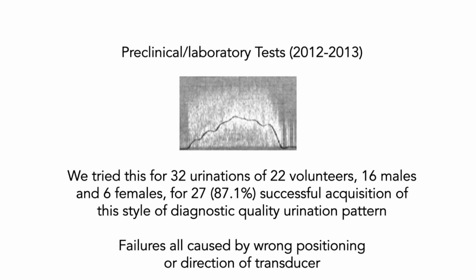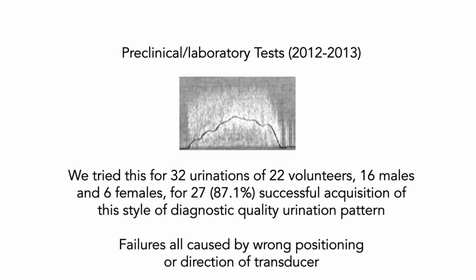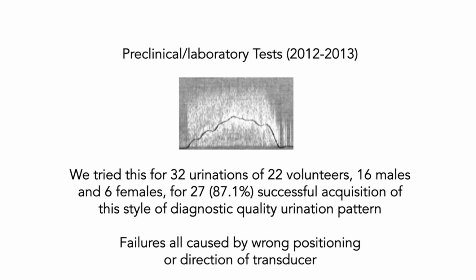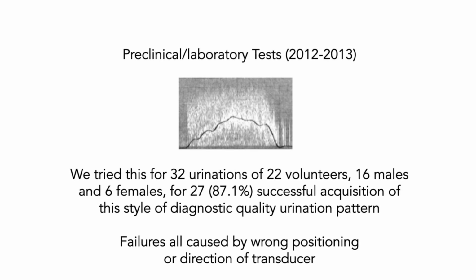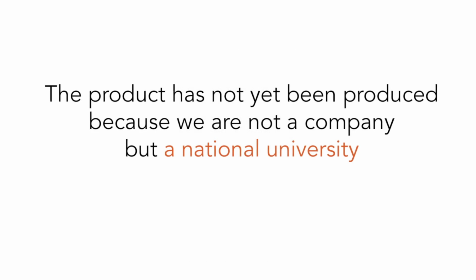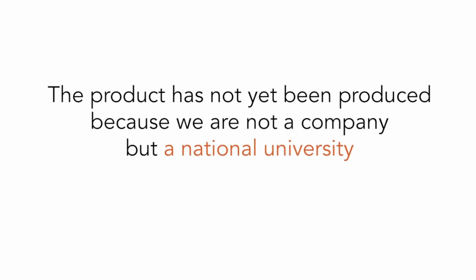During preclinical laboratory tests, over 87% successfully acquired this style of diagnostic quality urination pattern data. Yet, all failures were caused by wrong positioning or direction of transducer. The product hasn't yet been produced since we are a national university.